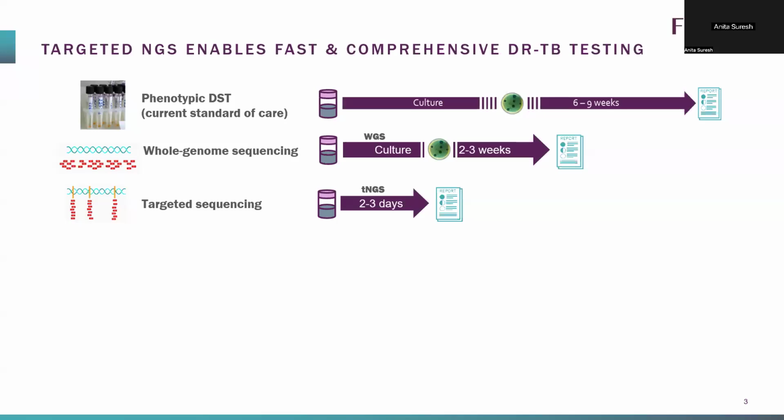Now this, you can start directly from sputum. And since you're focusing in on sequencing, amplifying and sequencing the very specific segments of those genes and regions within the bacterial genome, you're able to target it essentially for TB right there. So essentially, that's the reason why, at that point, there's obviously more improvements. We'll come to that towards the end of the presentation.